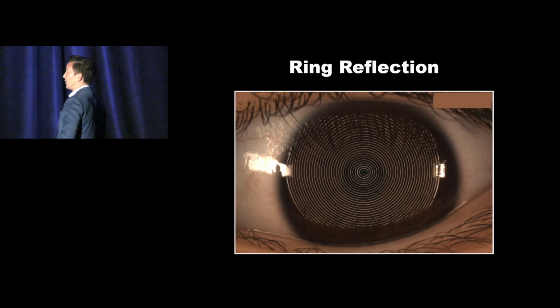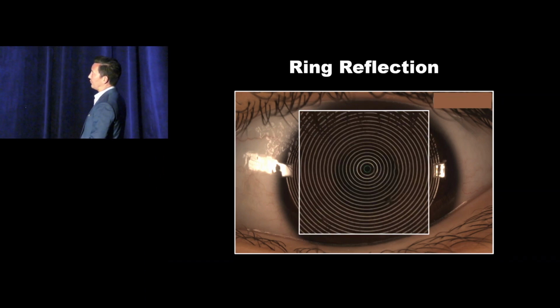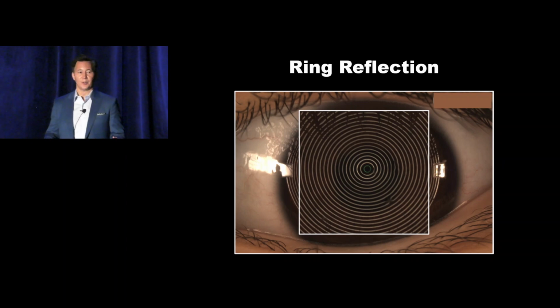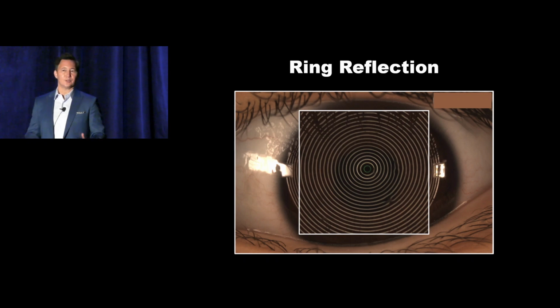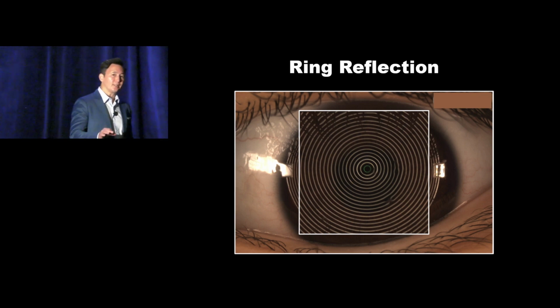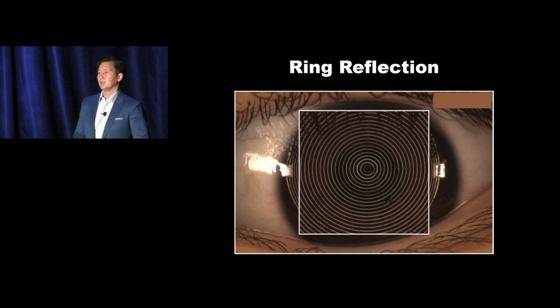Well, one of the things you want to do is zoom in. Any rings, especially in these first 10, could potentially ruin the entire topography. What the instrument does is it starts in the center, and it considers that sea level right here. If you want to measure the height, the shape, the whatever, it has to start with an understanding of the sea level. So if your central rings stink, then potentially the rest of the topography is utterly useless. So be really critical about those central rings.